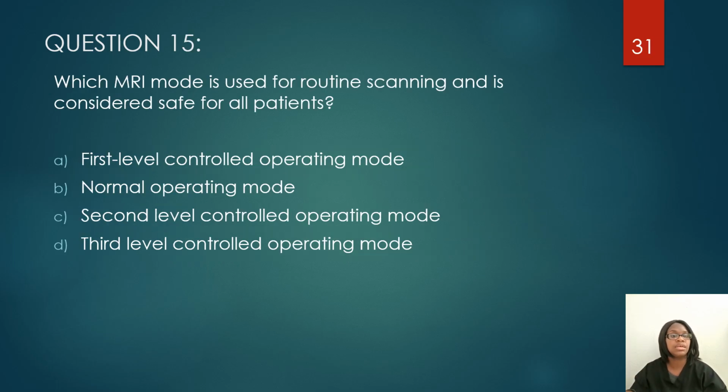Question 15. Which MRI mode is used for routine scanning and is considered safe for all patients? You have your first level control operating mode, normal operating mode, second level control operating mode, third level control operating mode. I'll just give you a few moments to answer this.